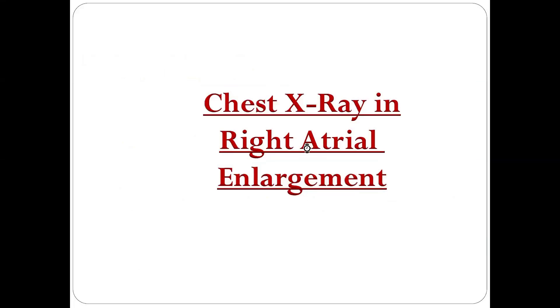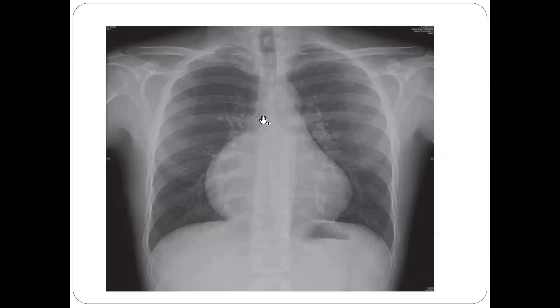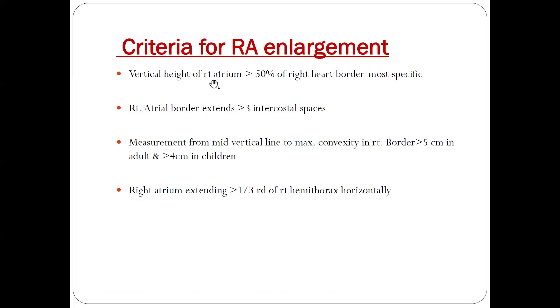Chest X-ray in right atrial enlargement. The criteria for right atrial enlargement on X-ray: first, if the vertical height of the right atrium is more than 50% of the right heart border, that is the most specific sign. As you can see here, this is the right heart border — the right atrium forms the right heart border — and since it is forming more than 50% of the right heart border, it is called right atrial enlargement.